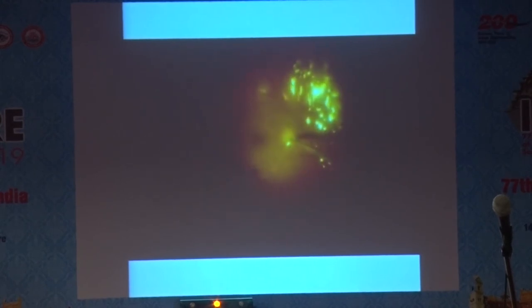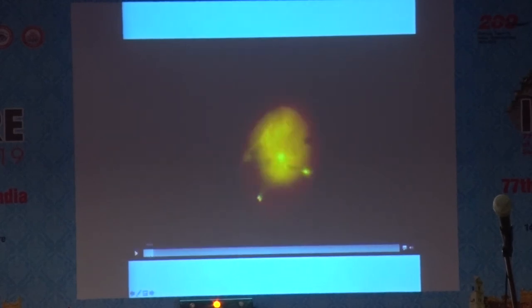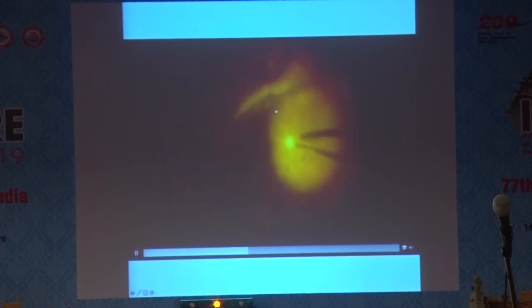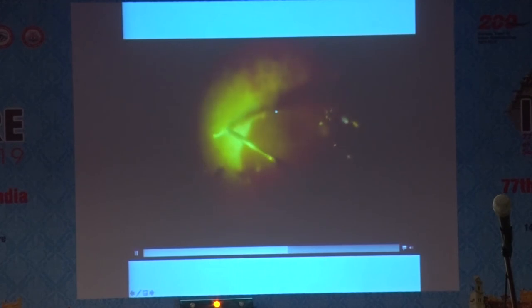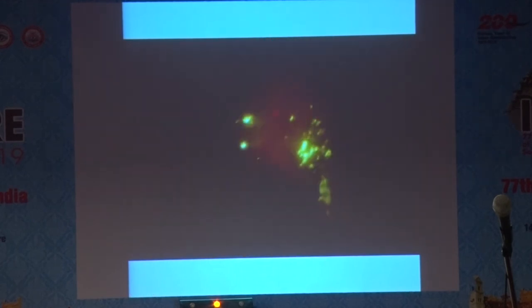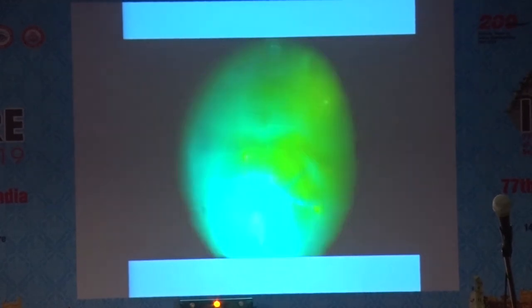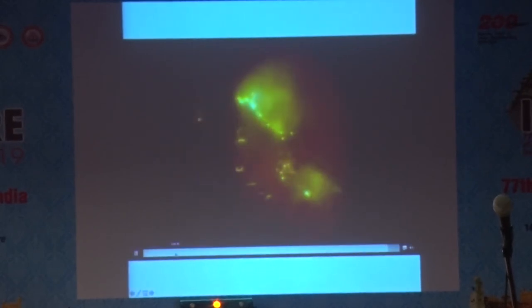And you can see that I left the hyaloid in that area in this patient. I didn't go overboard, especially over the active disease, because if I try to trim it too much or try to pull it like a normal PVR membrane, I may cause more damage in these patients. So shaving is the best technique in these patients. I did retinotomy in these patients, and then the barrage lasers, it is like usual, 2 to 3 rows of lasers are given in these patients before giving a tamponade.